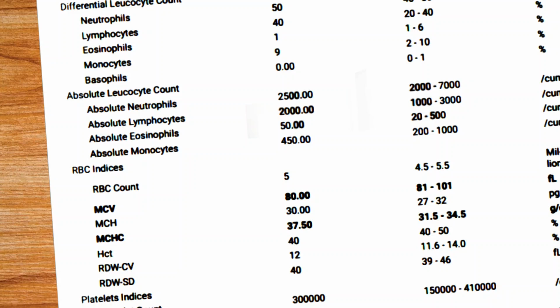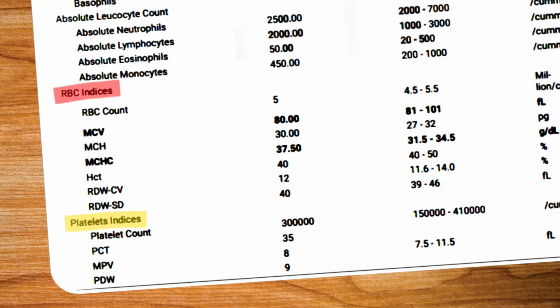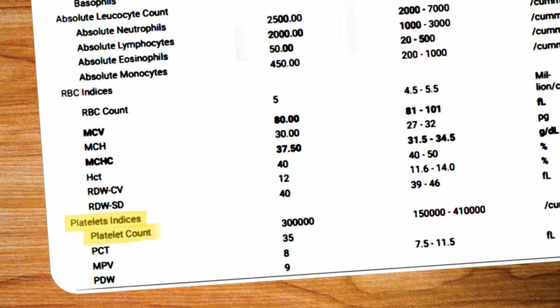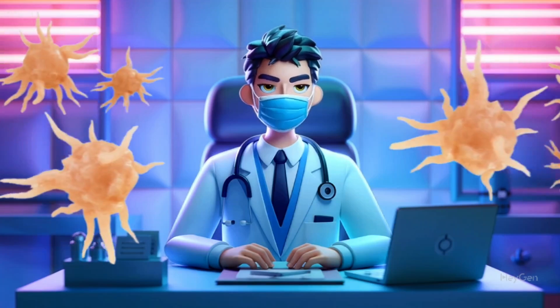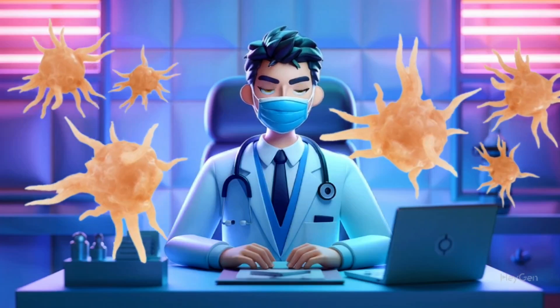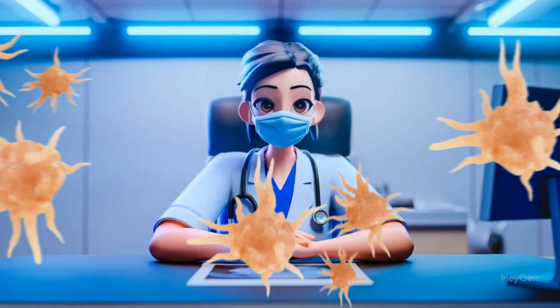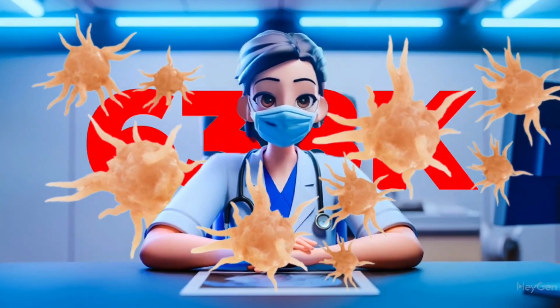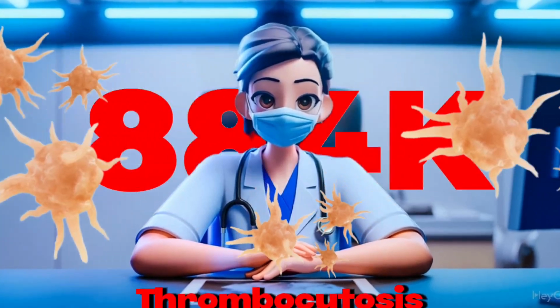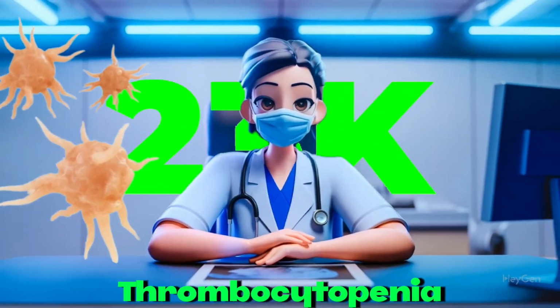Now that we are done with the RBC indices, let's move on to platelet indices. Let's start with the platelet count. The purpose of counting platelets is to measure the number of platelets present in total blood, which help with clotting. The normal range of platelet count is between 150,000 to 410,000 per microliter. The high level of platelet count is called thrombocytosis, and the low level of platelet count is called thrombocytopenia.